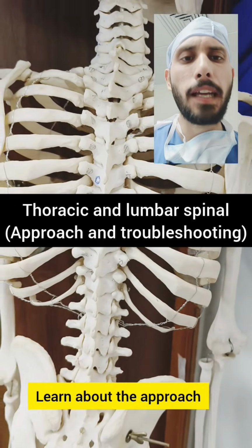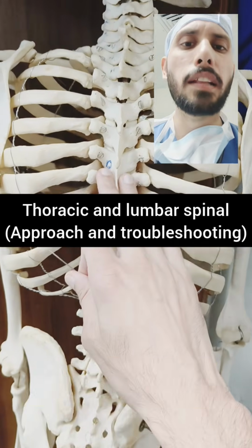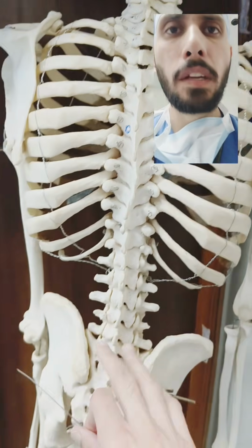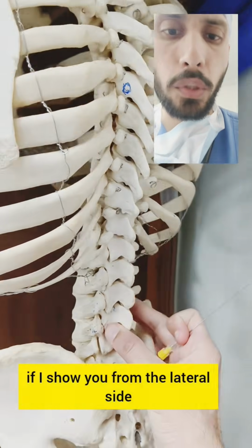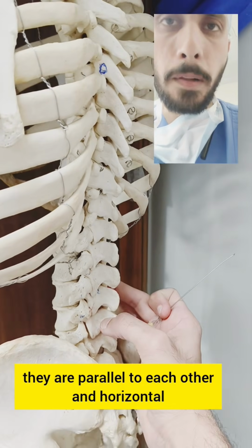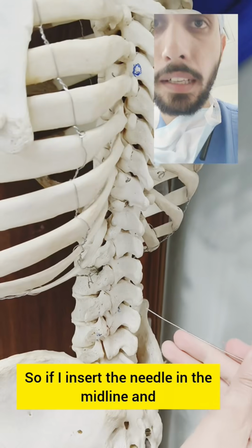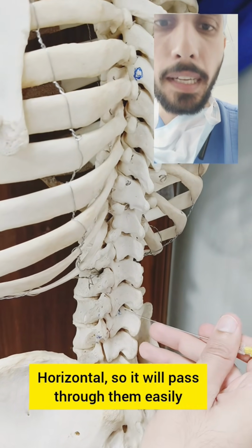Learn about the approach and troubleshooting of spinal anesthesia in the lumbar area and the thoracic area using this model. As you can see in the lumbar area, the spinous processes, if I show you from the lateral side, are parallel to each other and horizontal. So if I insert the needle in the midline and horizontal, it will pass through them easily.